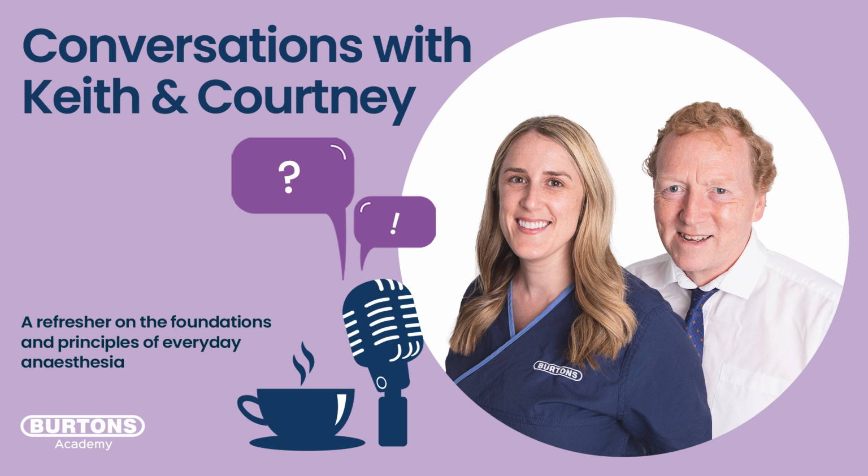So let's talk about circle systems, because I think they have a potential for inducing hypoxia through misuse or even misunderstanding of their use. One of the things I talk to a lot of nurses and vets about is the denitrogenation period, but I'm not sure it's fully understood. I think people know it occurs, but the mechanism and what happens during that period is perhaps not understood. Would you like to go through the denitrogenation sequence with a circle?